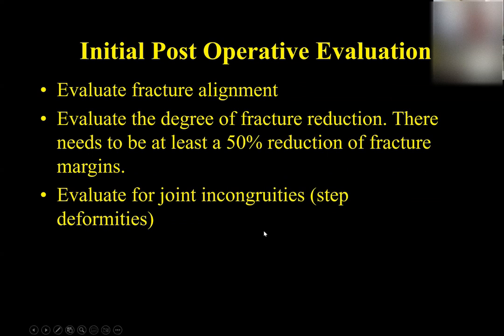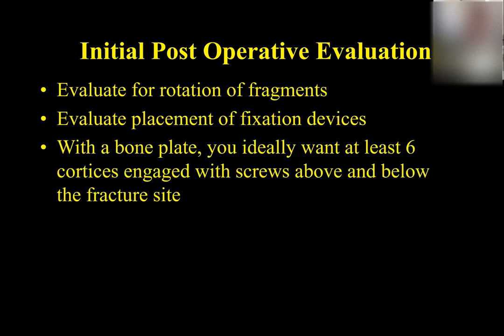Okay. And you want to look at, again, when you see a fracture in a long bone, like I said earlier on, you want to always take the x-ray, the radiograph, to where you see the joint above it and the joint below it, because you want to make sure there are no little fissure fracture lines that extend proximally or distally and could involve a joint. Anytime the fracture involves a joint space, that's a bad thing.